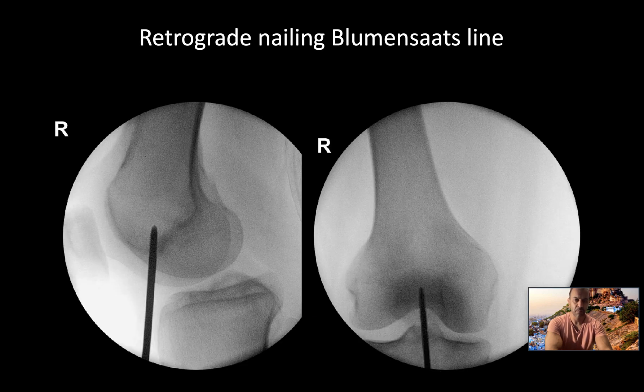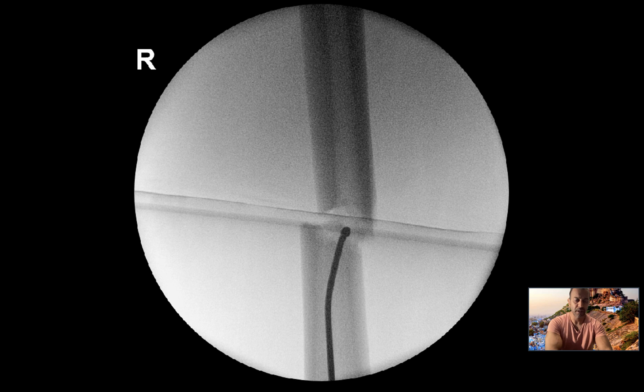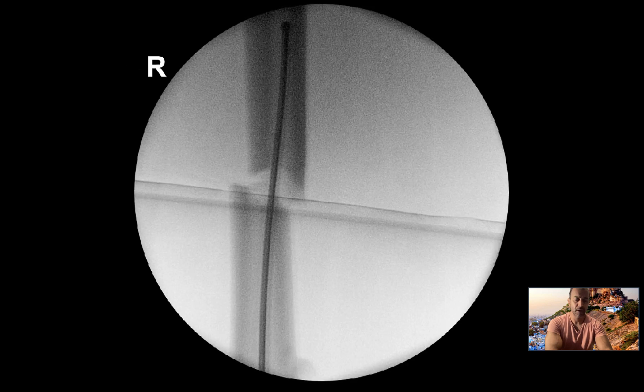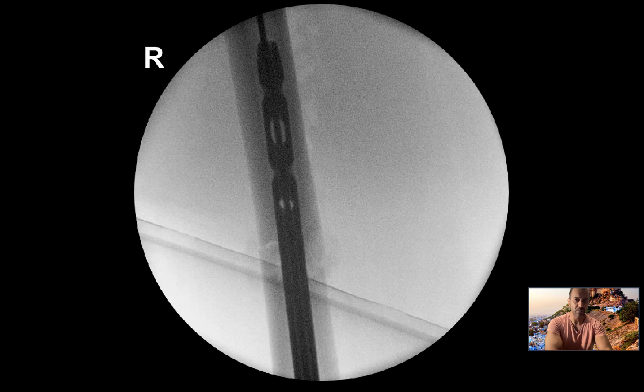Retrograde nailing, Blumensatz line entry point, get the guide wire up, and you've got a bit of deformity to reduce, just give the leg a little wiggle, and it straightens up around the nail.